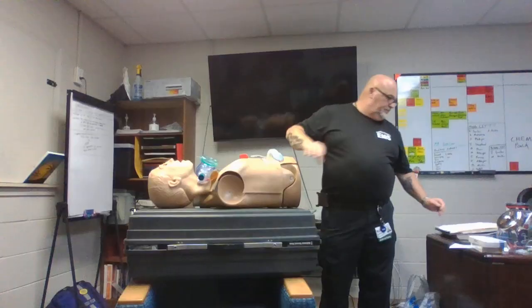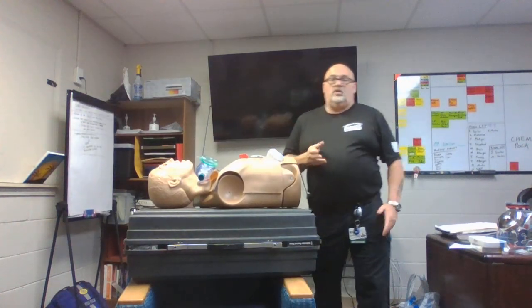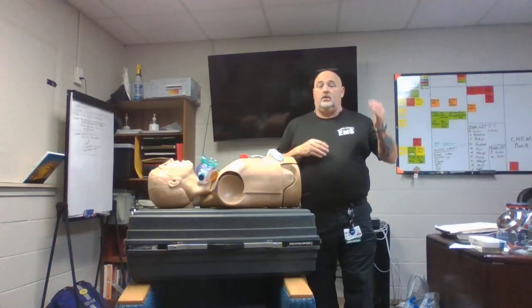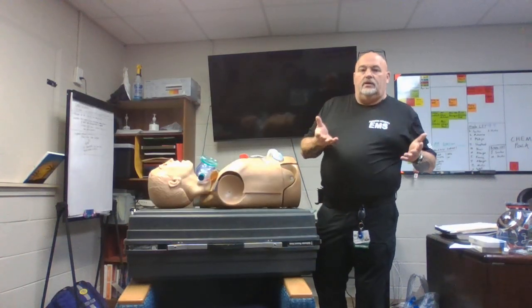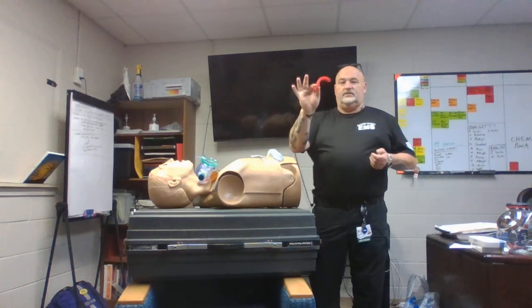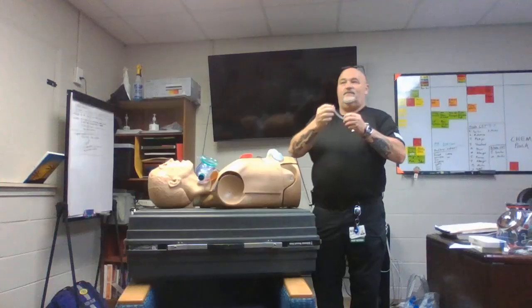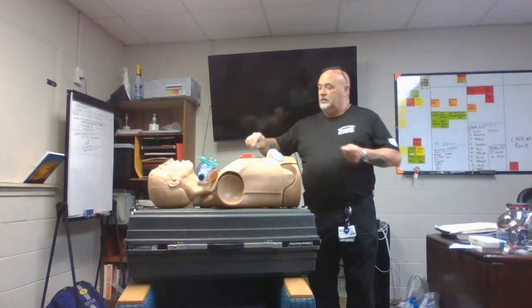So, airway adjuncts. What is an airway adjunct? It's a device that we're going to use to put in either the nose or the mouth of that patient to help secure that airway. Not really secure it, but open it up and hold it open for us. We have the OPA, which is the oropharyngeal airway. We have the NPA, which is the nasopharyngeal airway. Sometimes it will be referred to as a trumpet because it looks kind of like a trumpet.